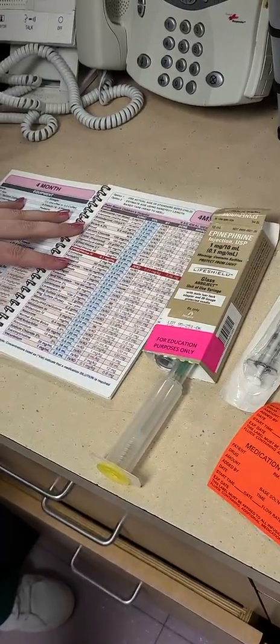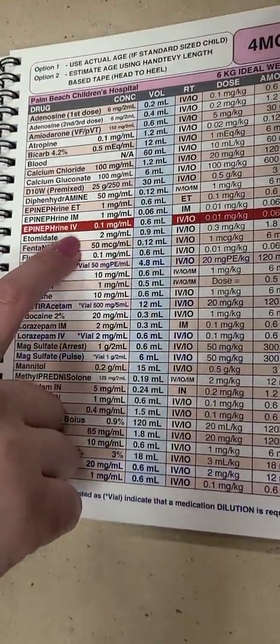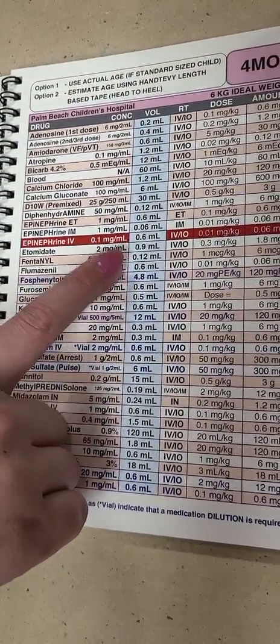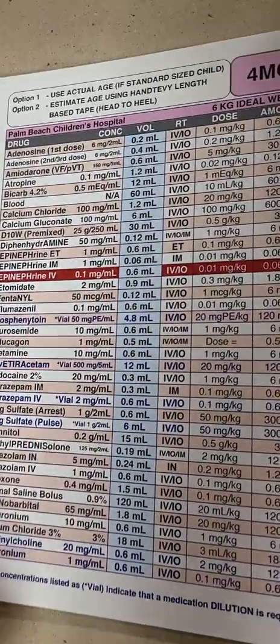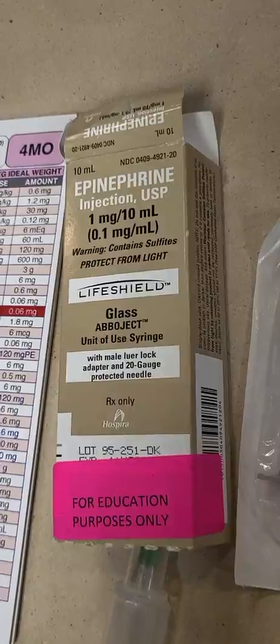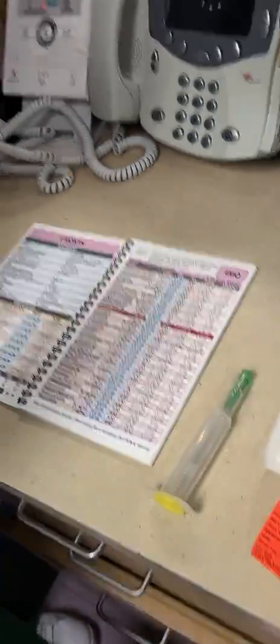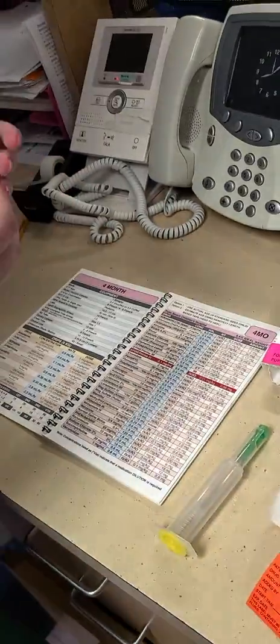So first I'll be drawing up an epi for this four-month-old. We can see on the hand tubby the epi dose for a code situation is highlighted in red. So that's going to be the 0.1 milligram to 1 ml epi, which is going to be this brown box here. And if we open it from the bottom, it opens up cleanly.